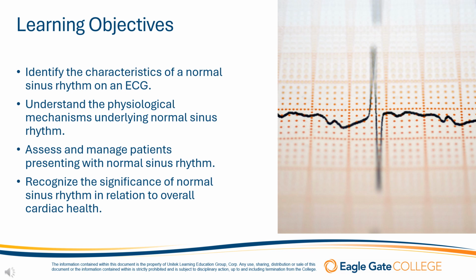Let's take a look at the learning objectives for this presentation. By the time we're done, you'll be able to identify the characteristics of a normal sinus rhythm on an ECG, understand the physiological mechanisms underlying normal sinus rhythm, assess and manage patients presenting with normal sinus rhythm, and recognize the significance of normal sinus rhythm in relation to overall cardiac health.